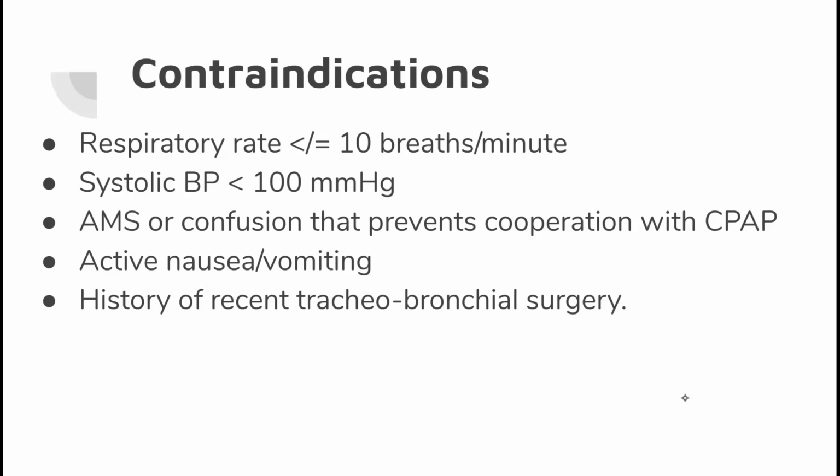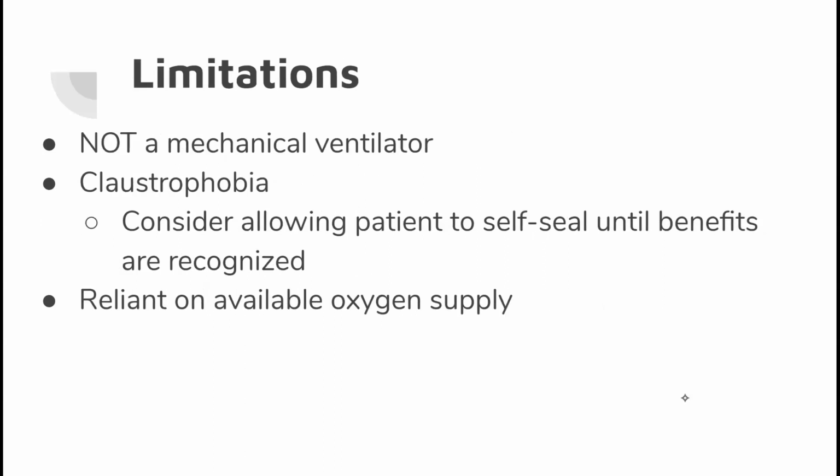Any sort of tracheal or lung surgery, right? You don't want to put too much pressure on a potentially weak area. For a lot of patients, the claustrophobia is the biggest issue. They have a hard time managing with this mask. It's kind of cumbersome. It covers most of their face. It can make them really anxious.